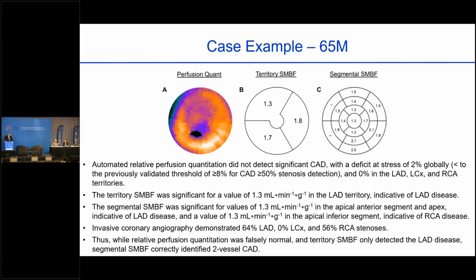It's a good question. We do have attenuation correction set up. We do very low radiation burden images, and that allows us to be a little bit more quantitative. The radiation dose just from this CT scan is low, and we can also get the calcium scoring, and we do see lesions in the lungs now and then. So I would tend not to bypass attenuation correction, but I do know that if you do O15 water, you don't need any attenuation correction. But for regular rubidium, I would still do it.